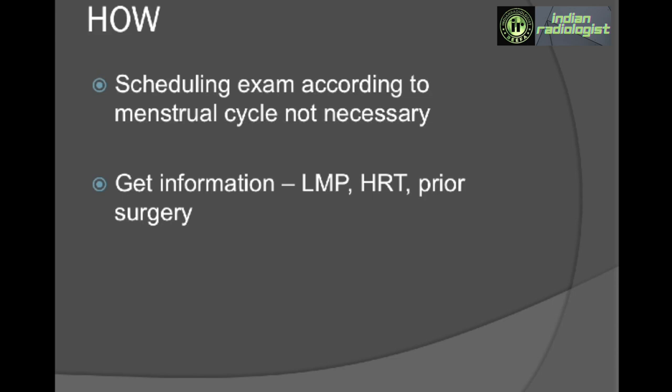Scheduling of exam according to menstrual cycle is not really necessary, because it delays the scan and the diagnosis and thereby delays the treatment process for patients who do have malignancy. But it is very useful to get information on the patient's LMP, any hormone replacement therapy that she's on, and if the patient has undergone any prior surgery.